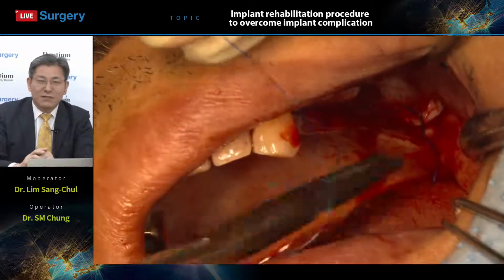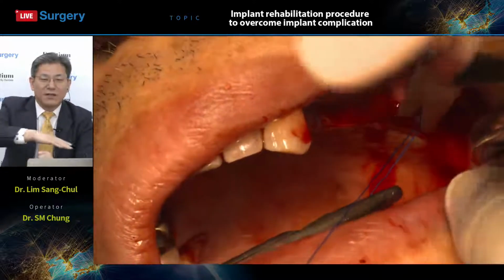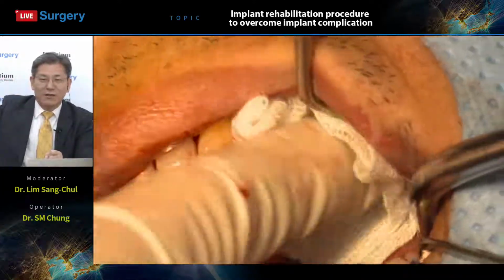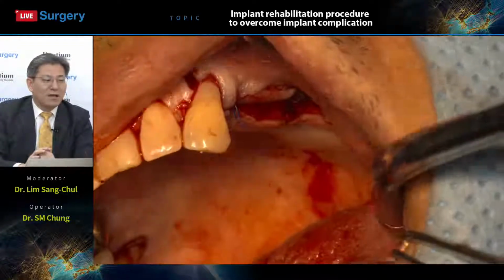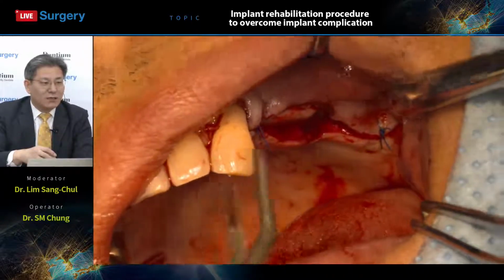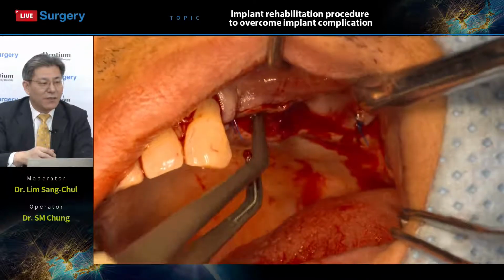But this Bright system, from the middle portion, gave us a stable insertion torque. It is very stable from this middle part of implant fixture, and then they almost have some flexure, and then the same level with a stable situation. It means, I think this kind of Bright implant system is a best combination with digital guided surgery, right?